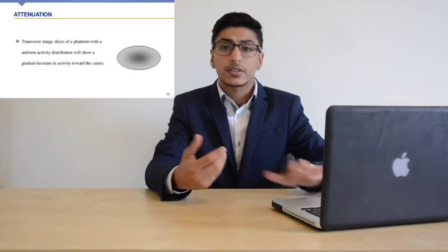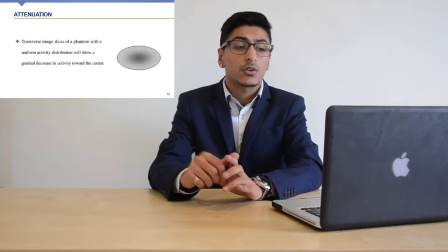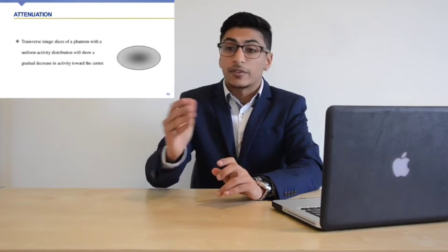Now, a little bit about attenuation correction. Before the gamma ray reaches the detector, particles follow a long path through the patient. Some particles may take a very similar path, but may pass through more dense tissue. There are other factors, such as these, which cause energy losses of the particle, which then result in poor count statistics. Poor count statistics also come into play with poor image quality.